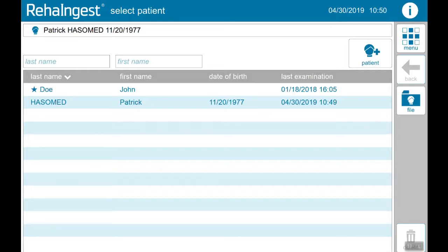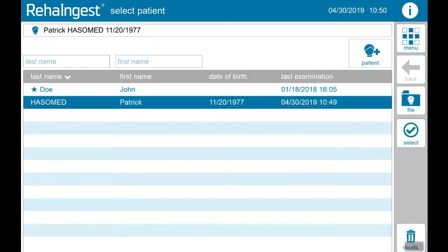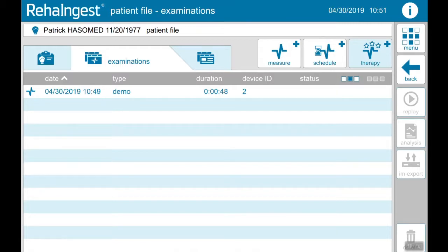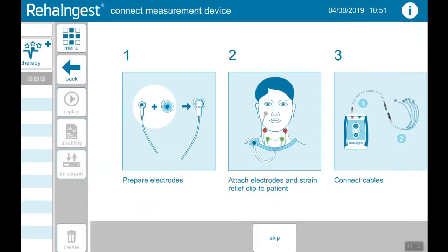First, choose your patient and tap on select. You will see an overview of all examinations. With measure you can add a new measurement. With schedule you can add a new long-term measurement, and with therapy you can add a new biofeedback training. Tap on measure.